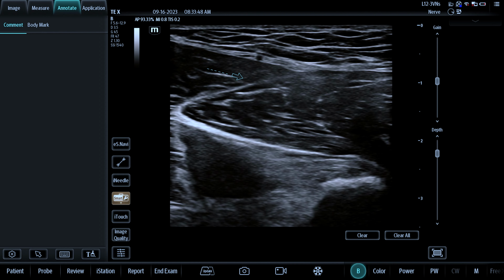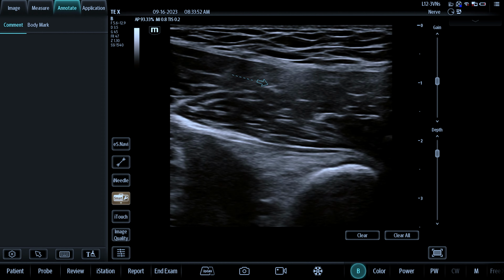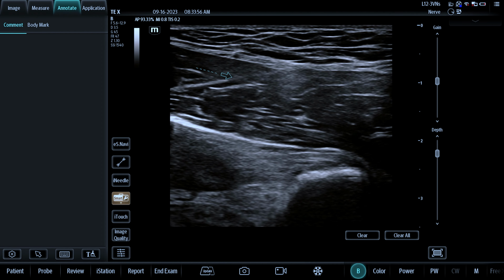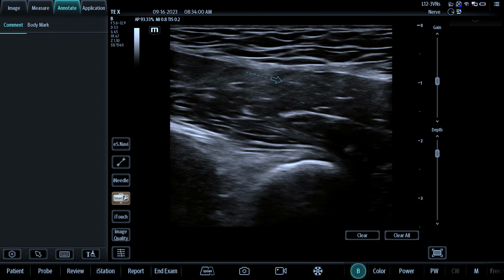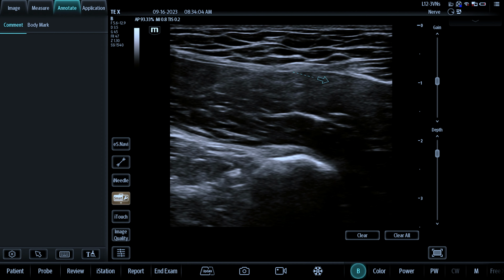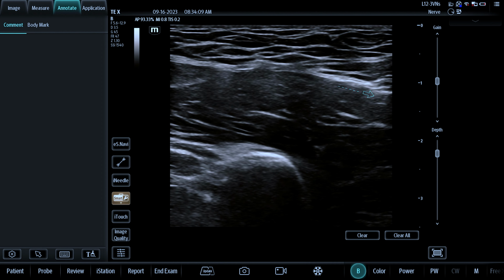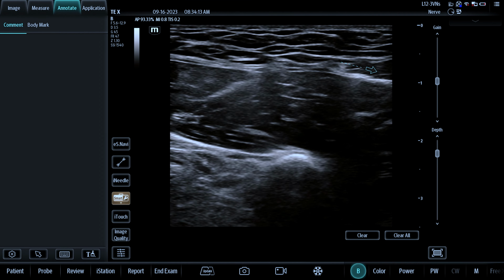I like going transsartorial, piercing through the fascia iliaca, and then start depositing your local anesthetic here. Once you do that, you'll notice the iliacus muscle usually kind of starts dropping, and you can advance your needle cephalad towards the umbilicus, injecting as you go until you see local anesthetic coming up this way underneath the lip of the internal oblique muscle, which is here.